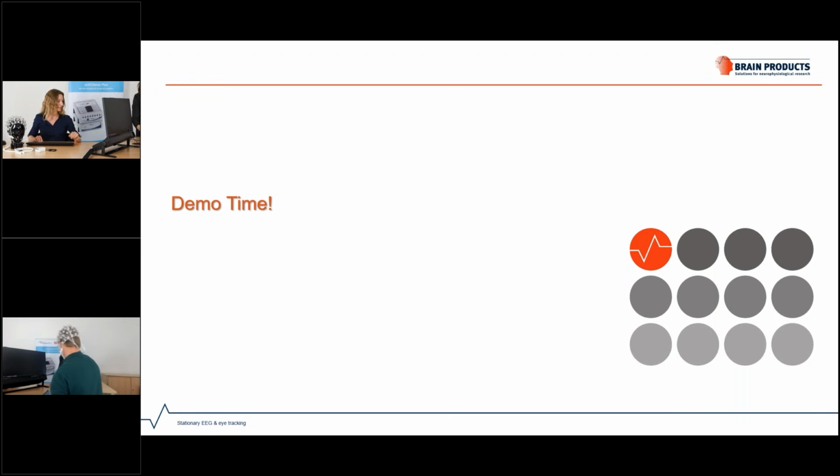Okay, StimTrack. Perfect. All right. Then let me show my different screen. One second. Yes, okay.